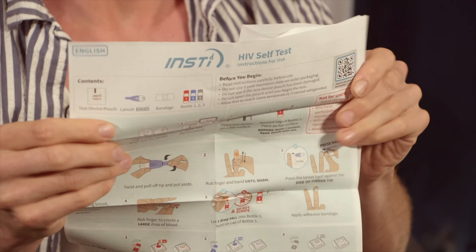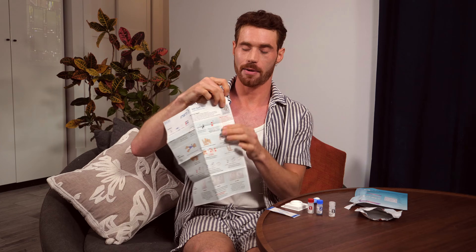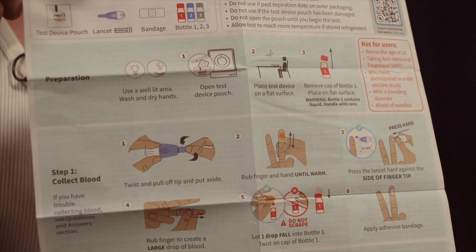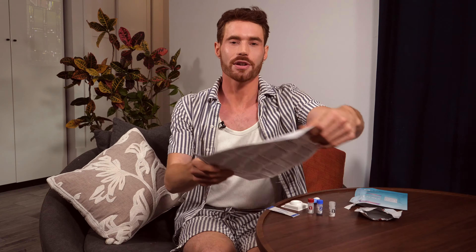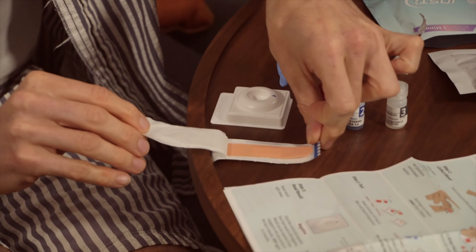Then you're gonna want to open this up and at first you might think, gosh that's a lot of words. Give yourself a breather — the main ones you need to care about are these. Take a minute; you're gonna feel like you want a drink. Don't do that. Read through this carefully so you can follow the directions as closely as possible. Pro tip: open the band-aid first because you only have two hands so you don't struggle through it.